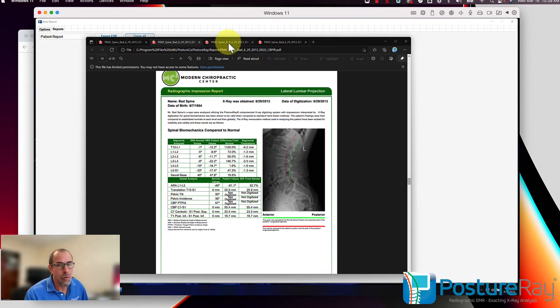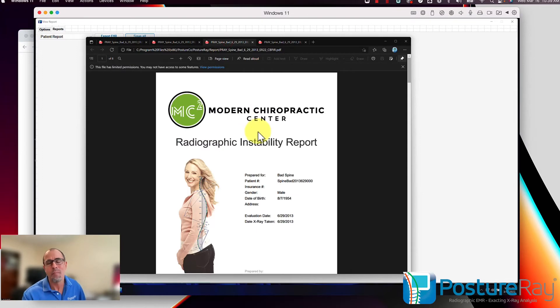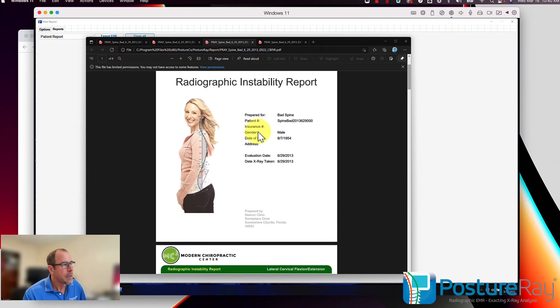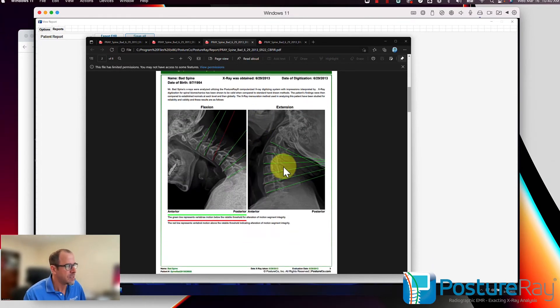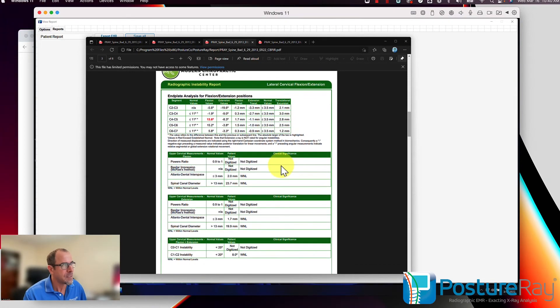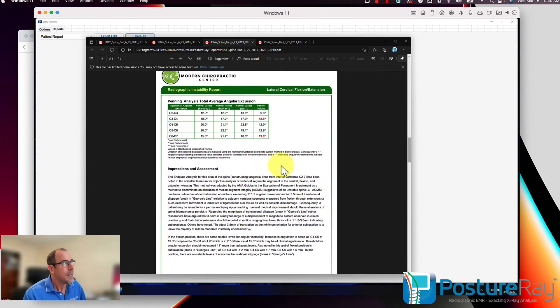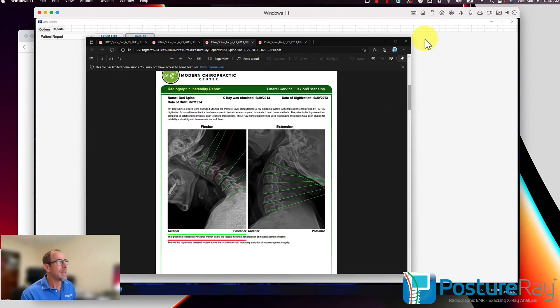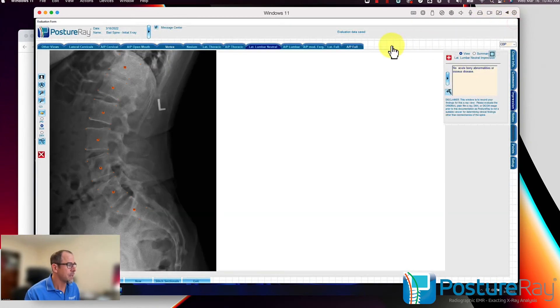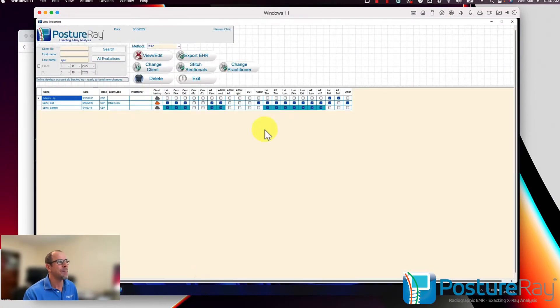We also do an instability report — the AMA guides fifth or sixth edition. In the impression report, that's also an instability report; we just named them differently. Here we have the AMA guides method of instability analysis showing the fifth edition and flagging instability with pennings assessment. Once that is done, PostureRay is truly exciting for preparing your report of findings for that patient.